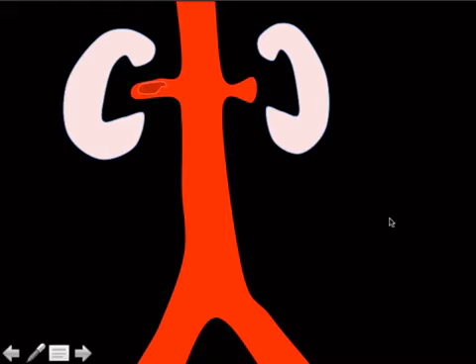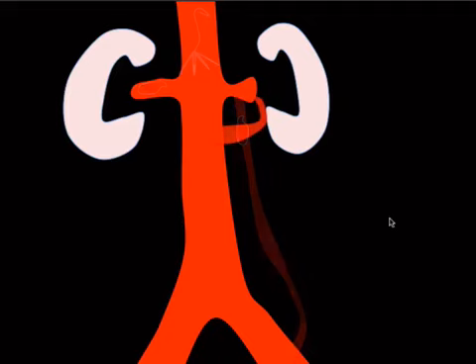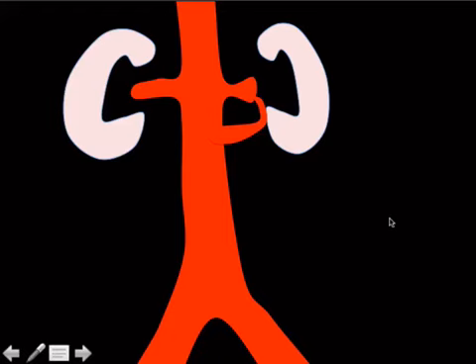So if you have clot in the renals or you've got clot in a gonadal vein, you'll want to place the filter above that, which makes sense, right? The whole point is to stop the PE, so you've got to be in a position to catch that. Another situation is if you've got a circumaortic renal vein, you want to be below the lowest renal vein. If you were above one, it could maybe go through and around like that, maybe. That's probably never been proven.